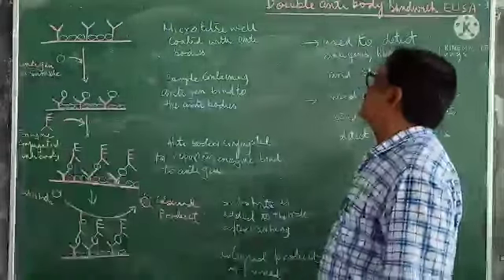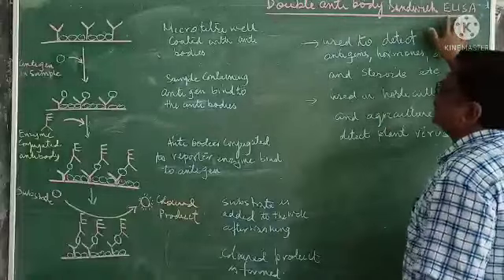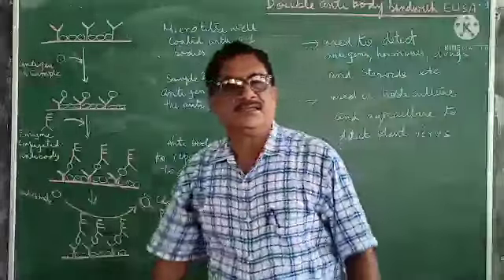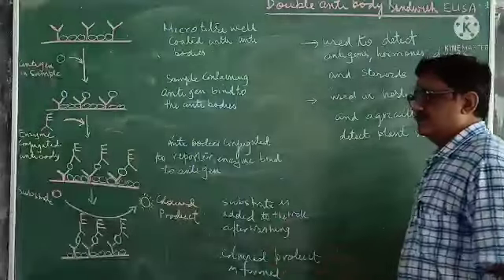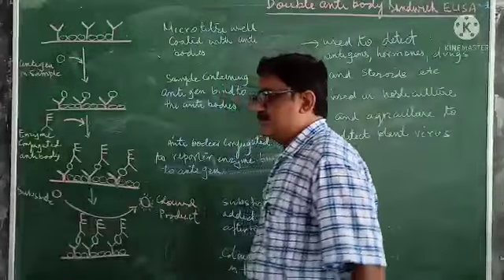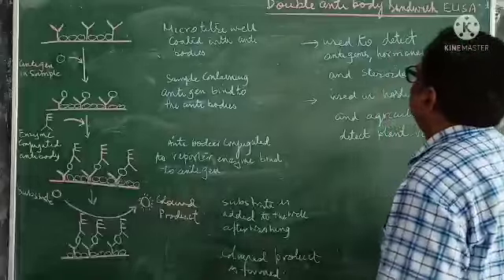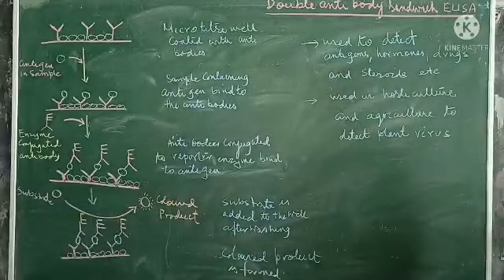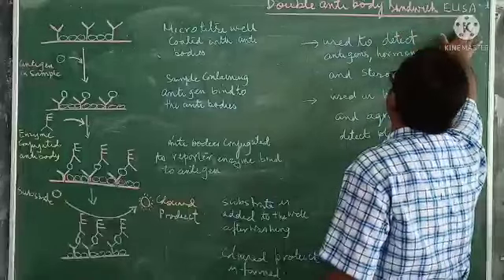Today we will discuss the double antibody sandwich ELISA. That is the second type of ELISA. Last day we discussed indirect ELISA, that is the triple antibody sandwich ELISA. Today we will discuss the double antibody sandwich ELISA.